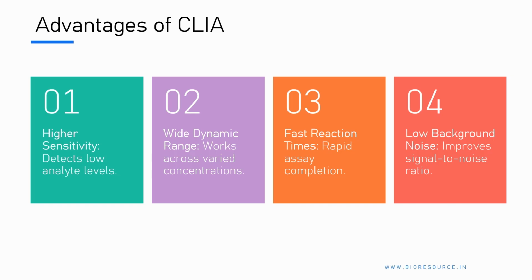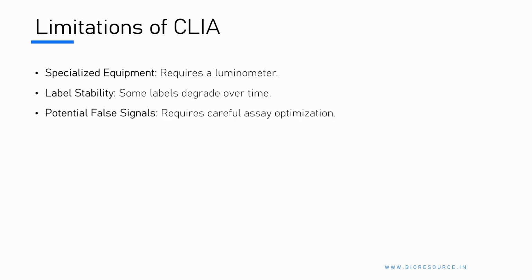So, due to these advantages, CLIA is widely used in clinical diagnostics, pharmaceuticals, and research, and it enables highly sensitive, rapid, precise detection of biomolecules, making it the gold standard for modern immunoassays. We have looked at the advantages of CLIA. Now let's see the limitations of CLIA.